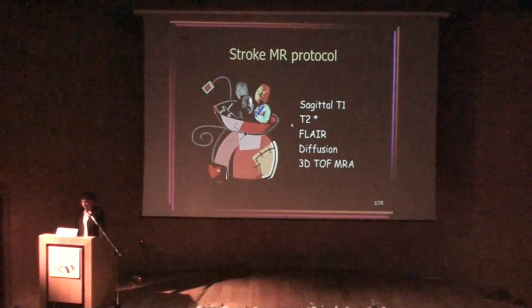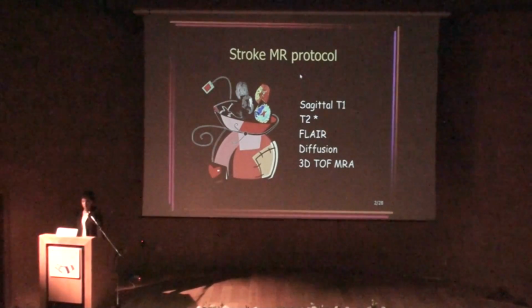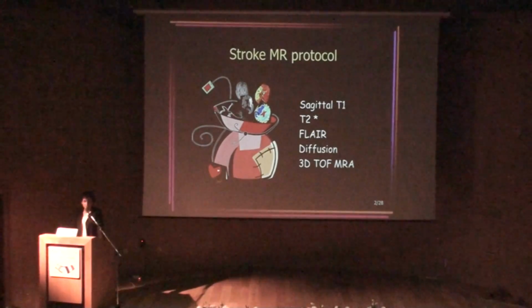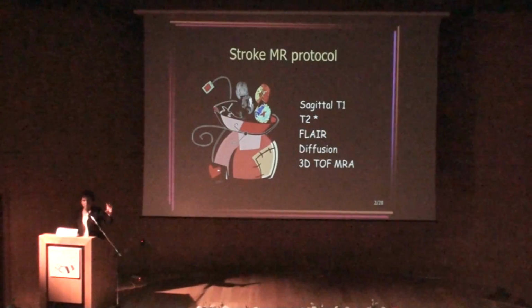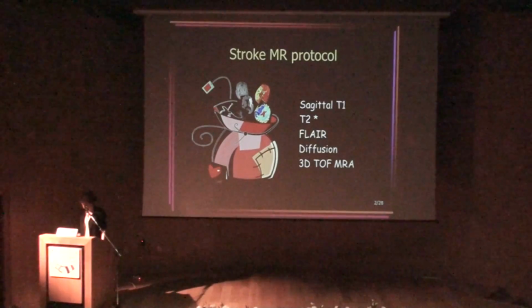I will, in fact, focus on each of the sequences that compose what we call the stroke MR protocol that we use every day to scan, I would say, 95% of patients. And I'm going to analyze sequence by sequence, trying to explain which traps you may face and give you some tricks to avoid them.